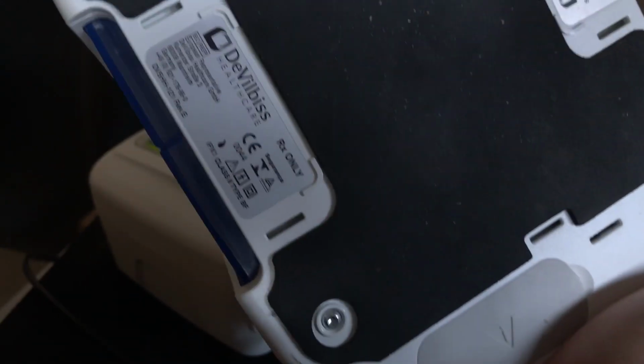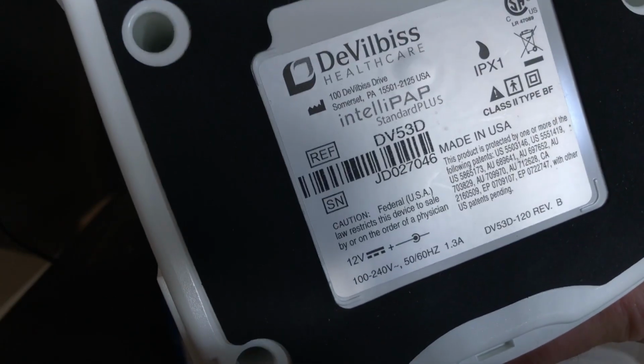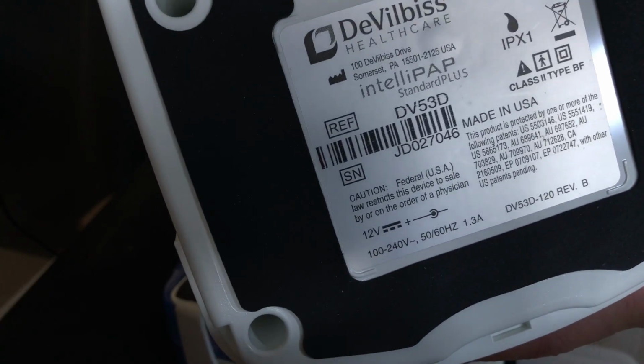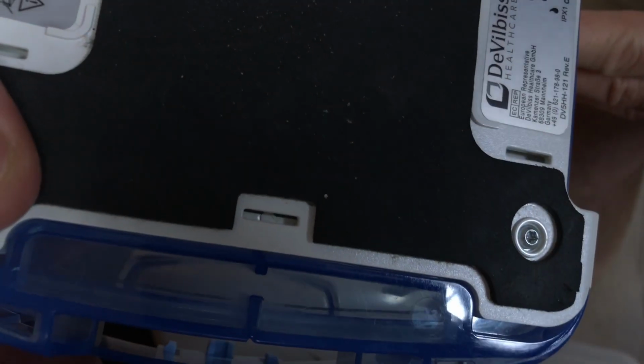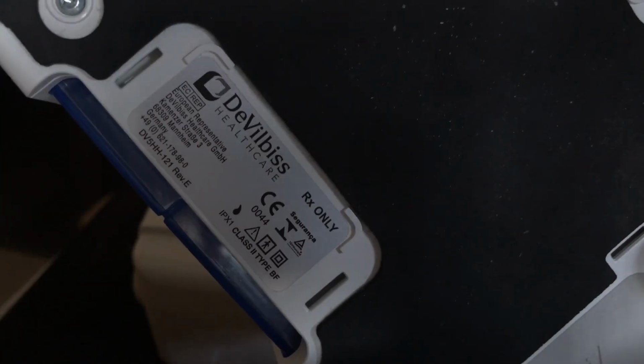So we're going to have a look inside of this unit later. I'm going to open up this one here as well, if we can access those screws, which may be a little bit difficult. This may end up having to be torn down. Anyway, there's a serial number. It's the DeVILBISS Healthcare intelliPAP StandardPLUS, and made in USA. And somewhere on here was a date. I just don't know where it is now. I could have sworn I saw it. Not there though. Anyway, it'll come up and I'll show you.